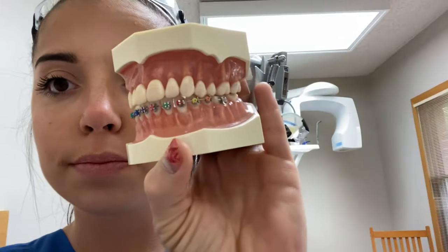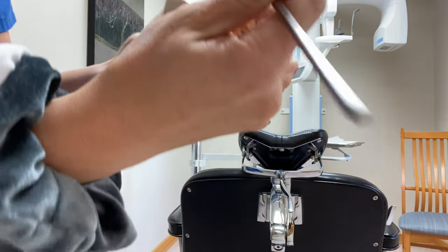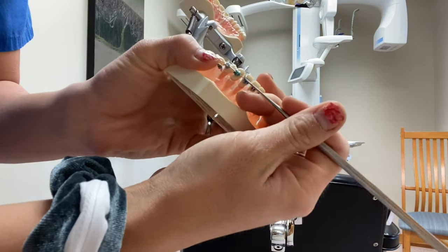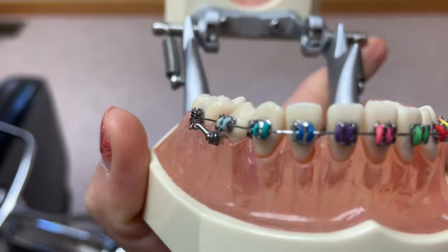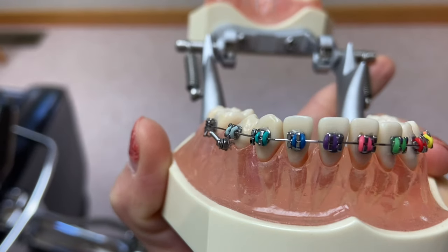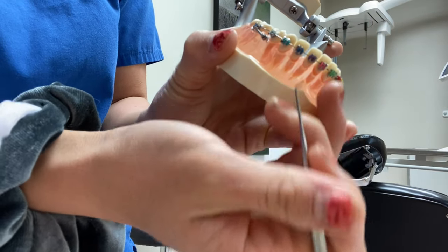I'm going to show you guys how to take the color ties off and how we put them on. So we have our little friend here with the braces. I'm going to show you how to take them off — I don't know how I'm going to set this up to show you, but here we go. Usually they're open, so I'm just going to move the top. There are four wings to a bracket and right now it's only on two on the left side — the pink and the purple one are on the left side, that blue one's on the right side. It's supposed to be on all four. Don't mind my nails.